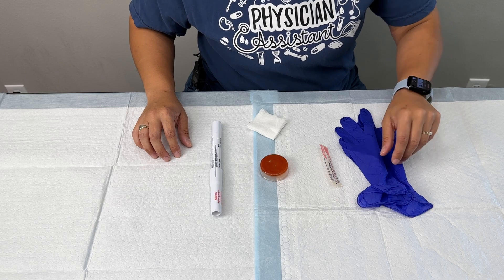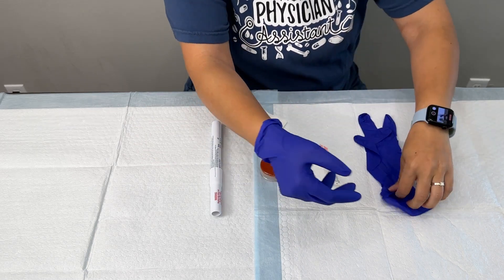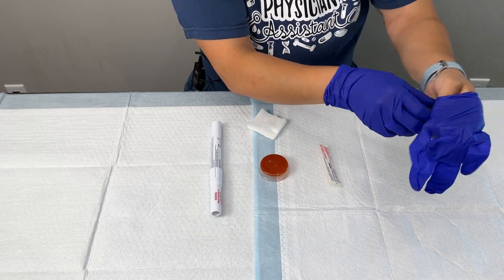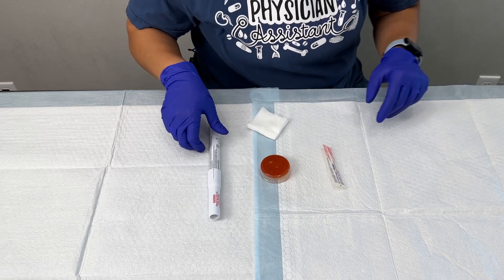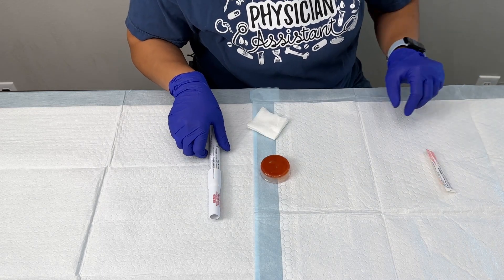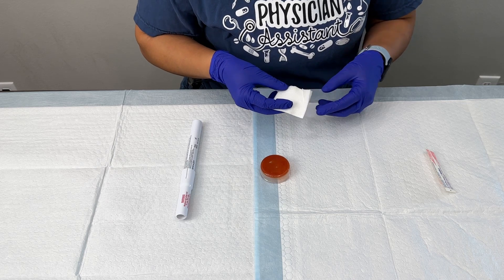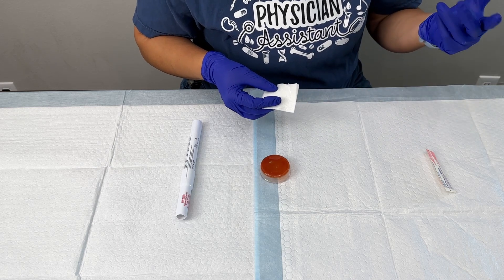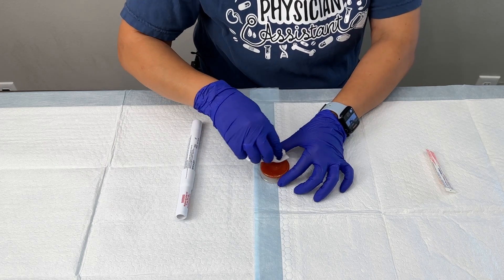The first thing we're going to do is put on our non-sterile gloves. The first technique I'm going to show you is utilizing the electrocautery pen, so we'll keep our 18 gauge here to the side. I'm going to take some sort of cleaning solution — it can be betadine, chloroprep, or alcohol — and clean the top of the nail.